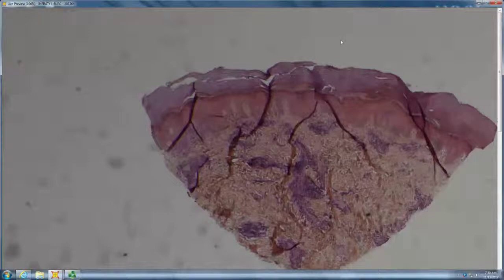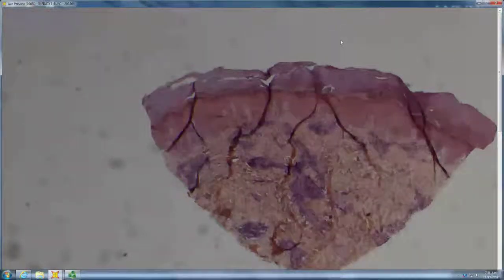But what you do have is lymphs, and every lymph sits on a background of white, right? And that's the so-called fluffy edema of the vessels. So this is a good example of it, where every lymph is discrete, they're not even overlapping, and there's extra white sitting around it.